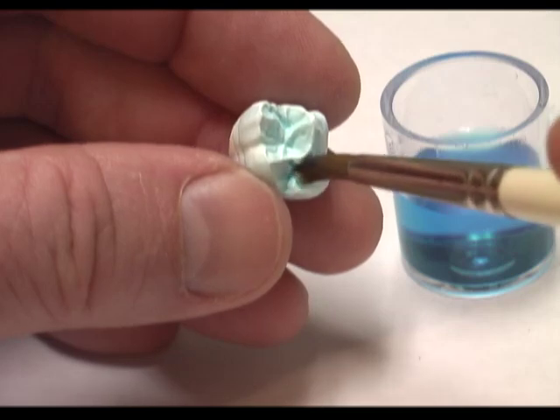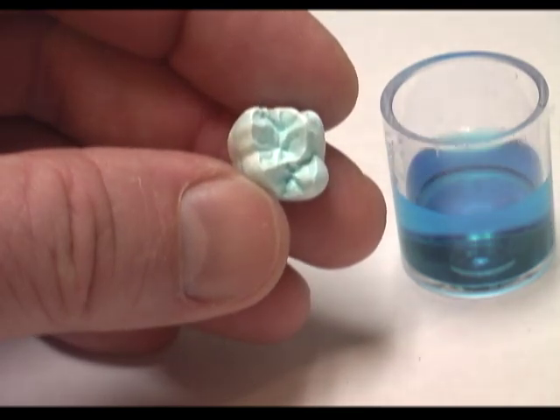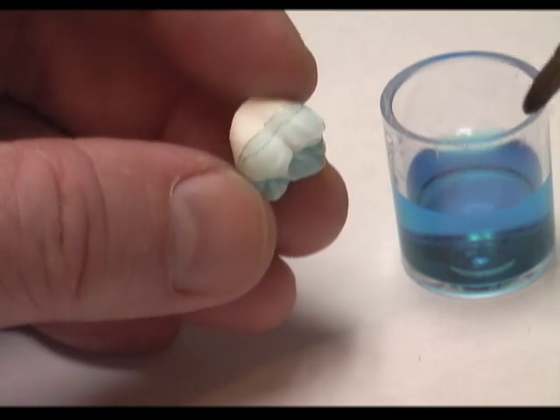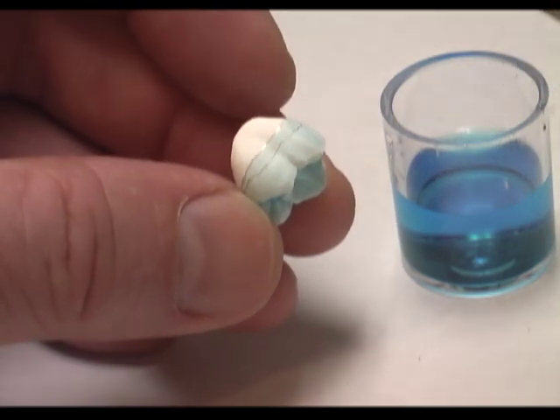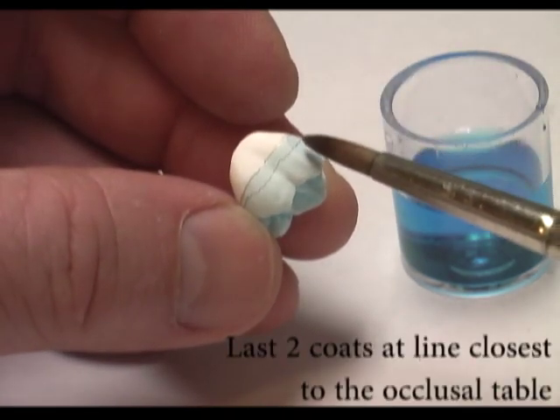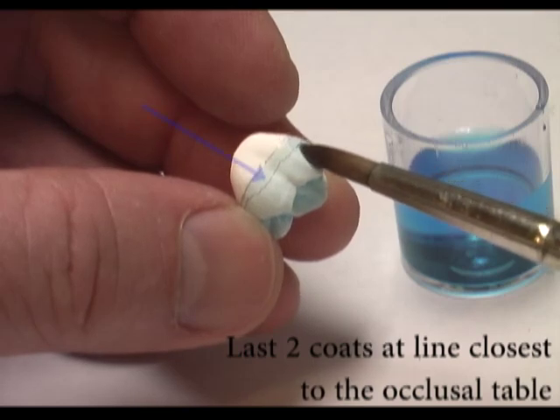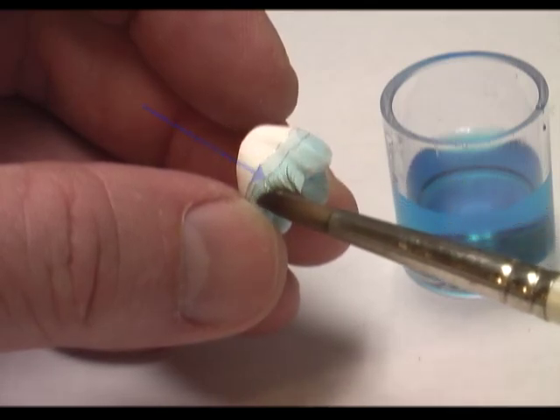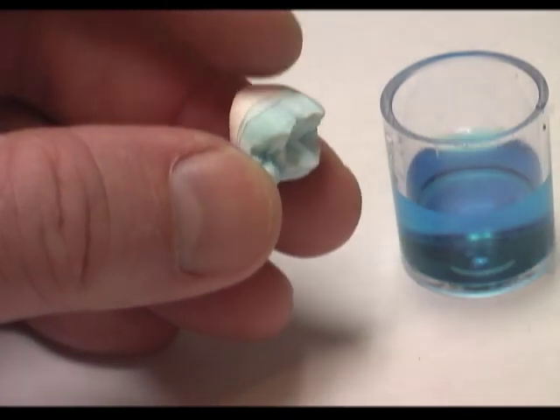The first three coats of enamel will repeat this process down to that lower line. Once we have the three coats on, our last two coats will start at the line closest to the occlusal table — we won't go down to the lower line like we did the first three times.